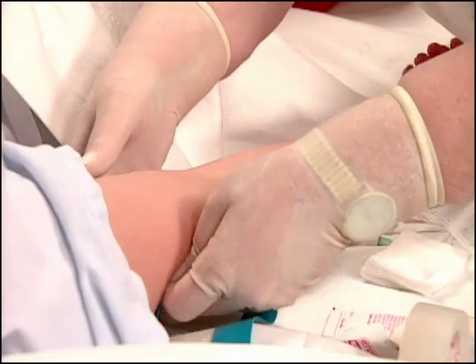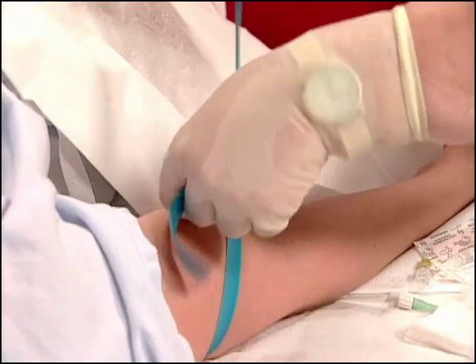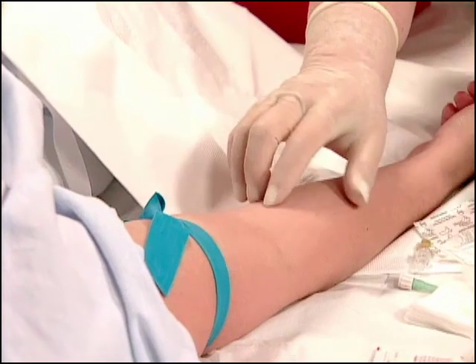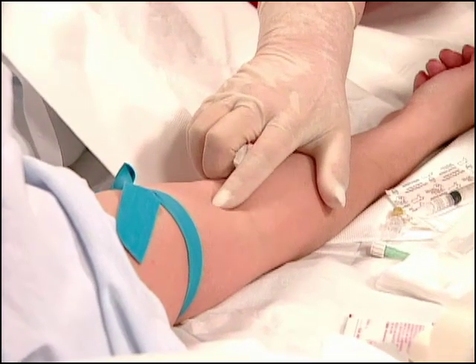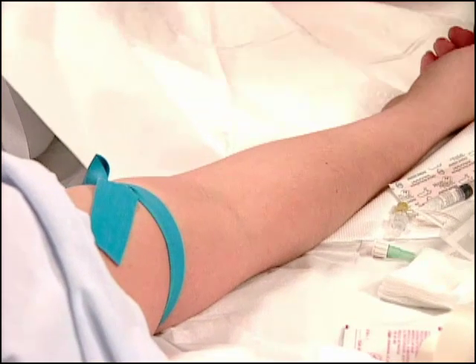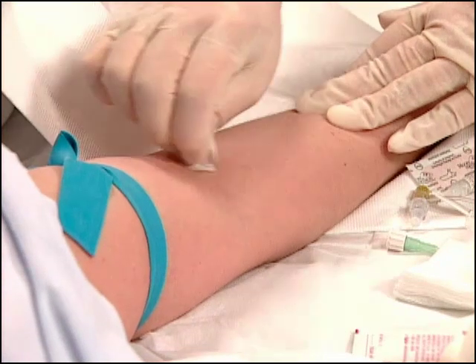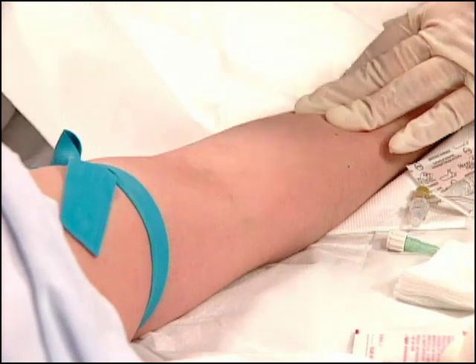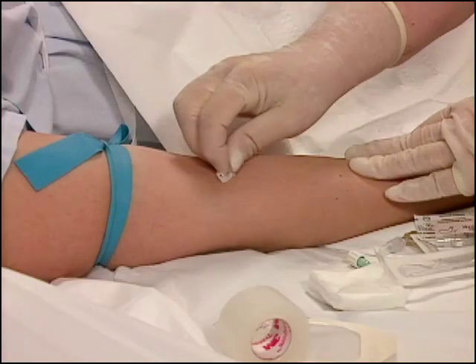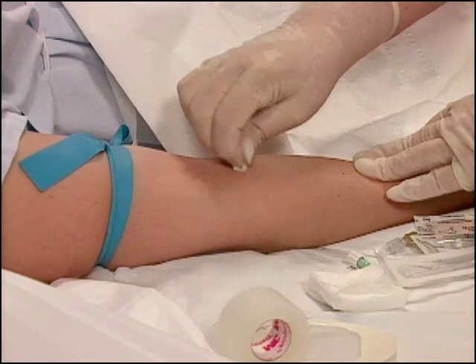Apply the constricting band 10 to 15 centimeters or 4 to 6 inches above the chosen insertion site. When the vessel engorges, palpate it for straightness and sponginess. Then begin the cleansing procedure. Holding the alcohol pad or iodine swab in your gloved hand, wipe in a circular fashion from directly over the proposed insertion site in ever-increasing outward circles. Allow the wet area to air dry, or wipe with sterile gauze. Do not blow on or fan the site.